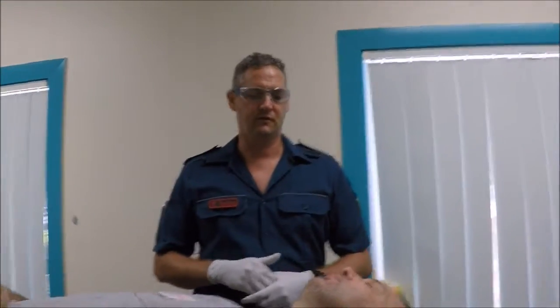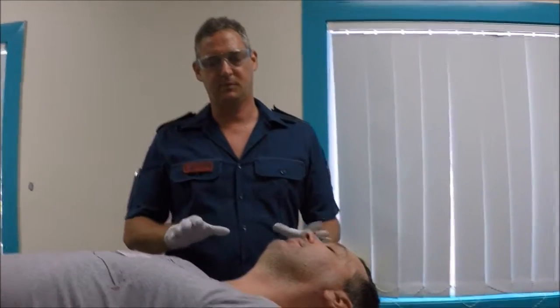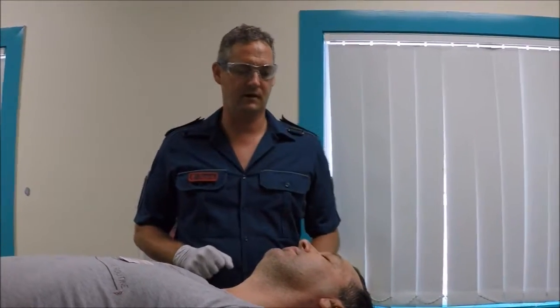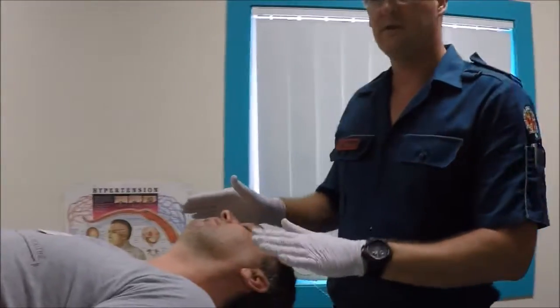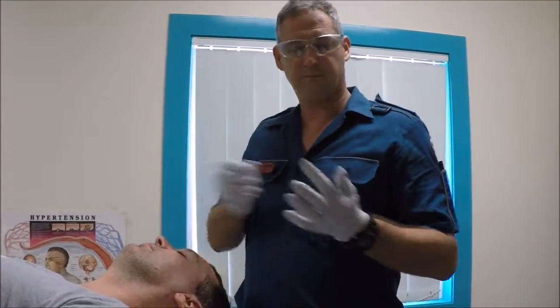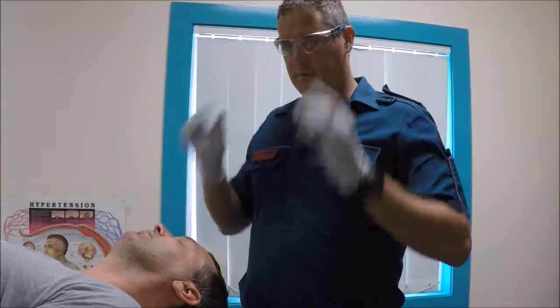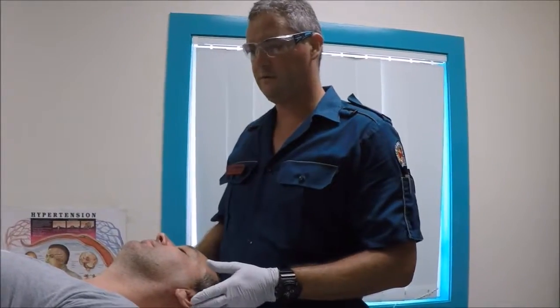Okay, so I'll give a practical demonstration of the actual procedure of external jugular venous cannulation. Brian, my colleague from work here, is going to be my model. I won't actually cannulate because it's beyond my skill set at this stage, but I'll simulate the cannulation. In preparation for an EJ cannulation, positioning of the patient is very important. First of all, making sure we've got our safety equipment on, goggles, gloves. It's a high risk body fluid contamination procedure, so we want to make sure that we've protected ourselves.